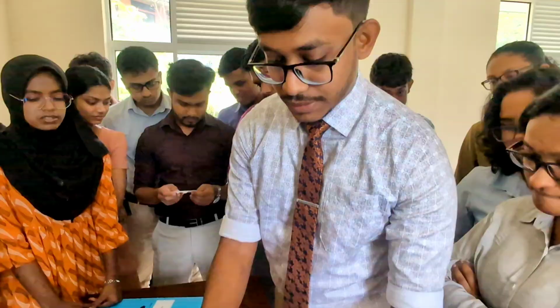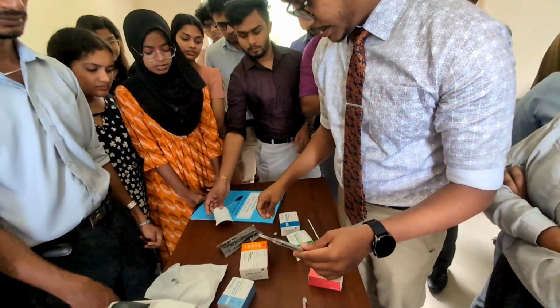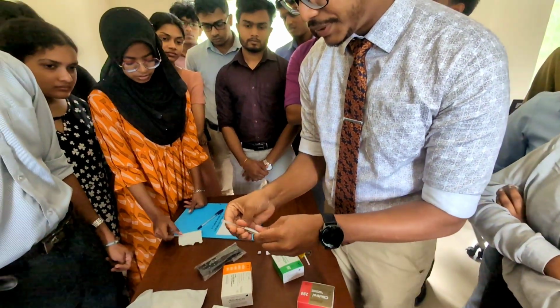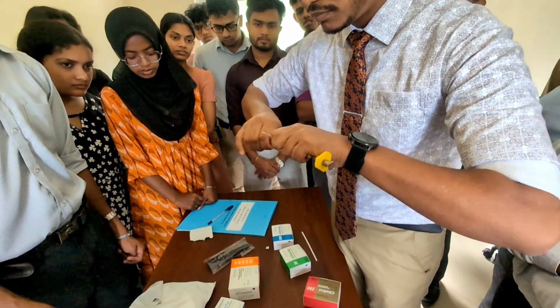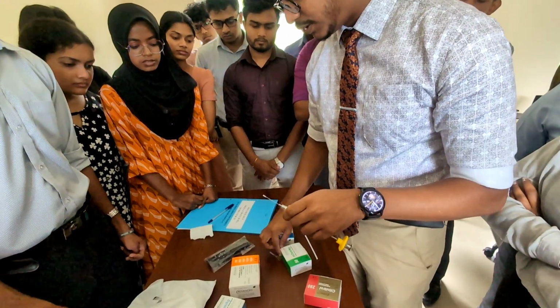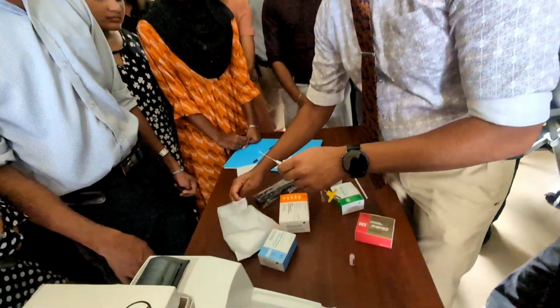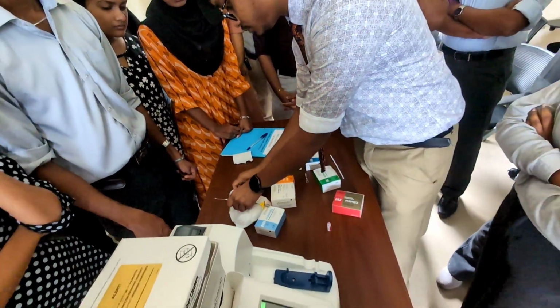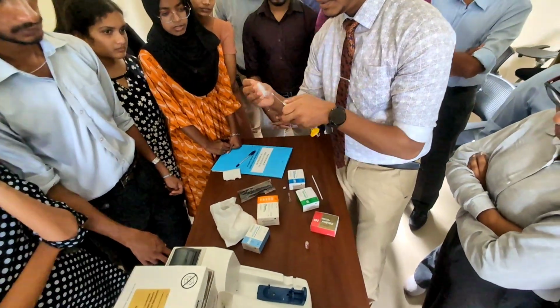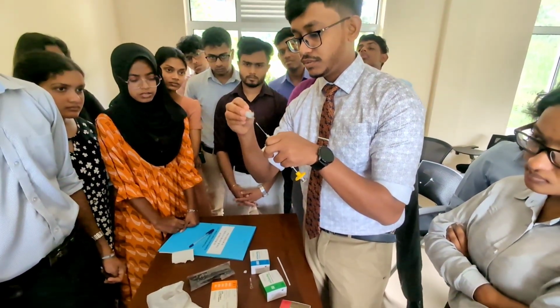Once the measurement has been done, we have to remove this and remove the tip. We cannot use this again. So remove the tip and clean the holder with cotton or whatever.